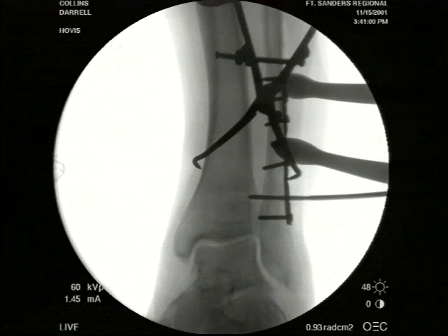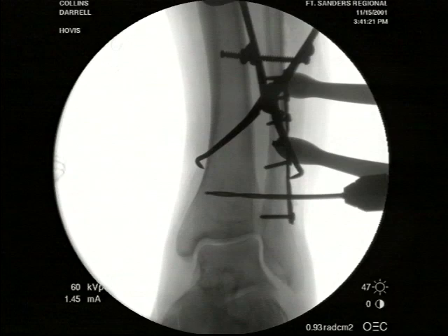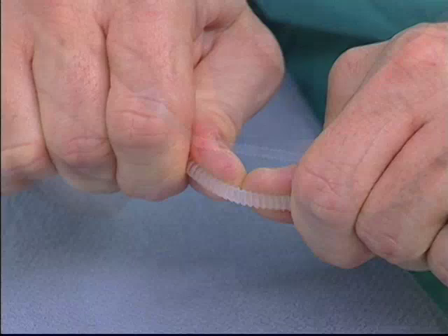We're going to purchase four cortices. When using a metal screw, some surgeons would prefer to purchase three, some four. With the bioabsorbable screw, our feeling is that it's not as strong as a metal screw, and the extra cortex of purchase is a good thing. The bioabsorbable screws that we're using are polylevolactic acid.